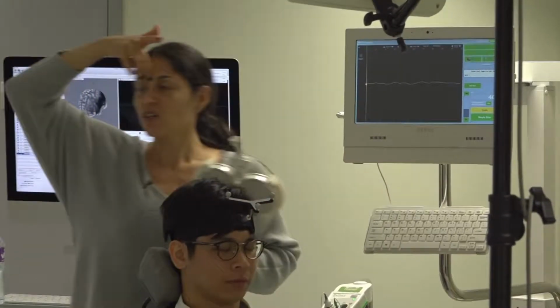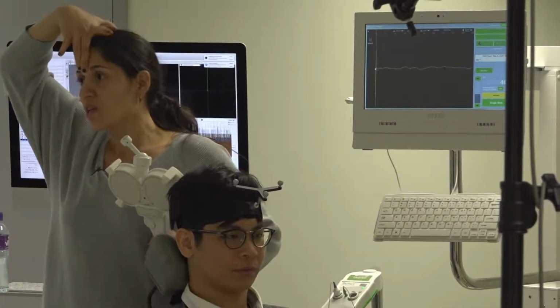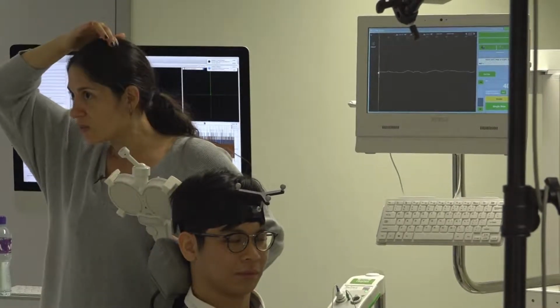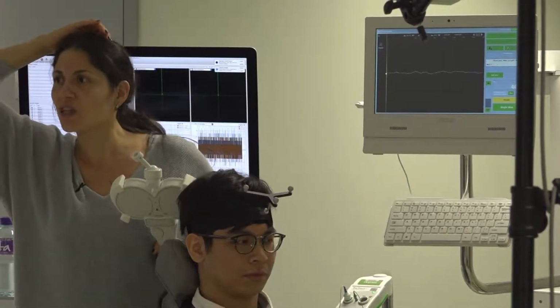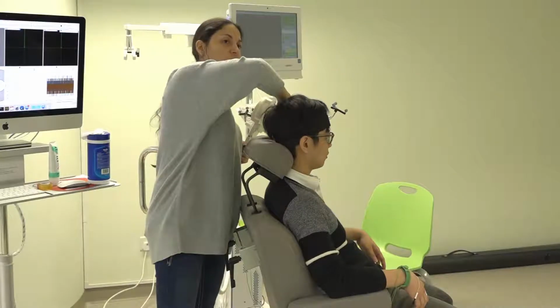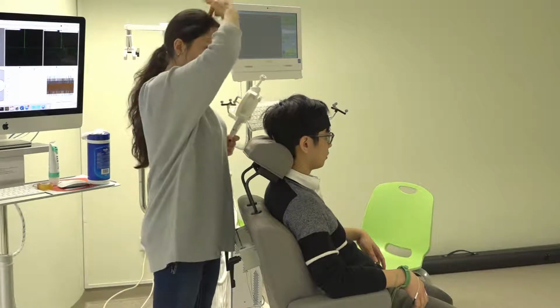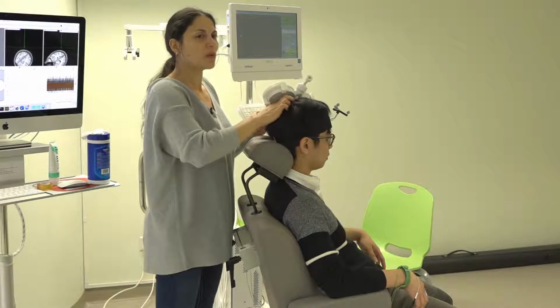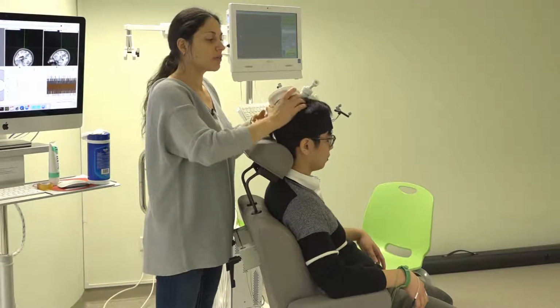So one way to find the motor cortex, where I normally do, okay, we have this thing here, from the inion, it should be the central one third. In this area, more or less, you will find the motor cortex. It is quite accurate. I don't see it, so it should be somewhere here. This is the middle point, and then I'm going to try here. But it will not work because it needs a higher intensity.